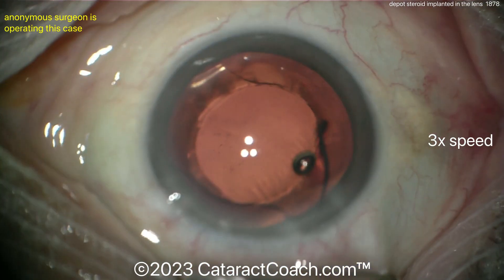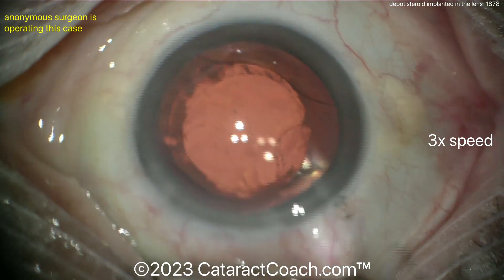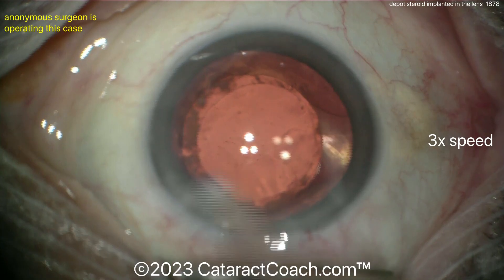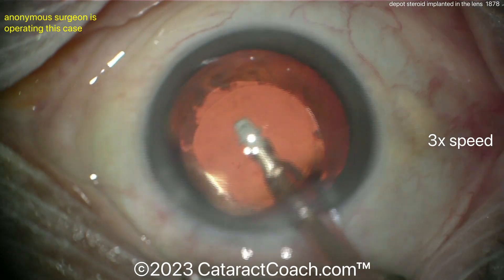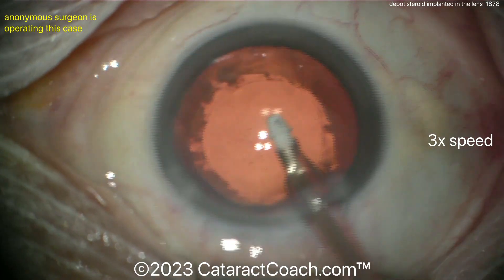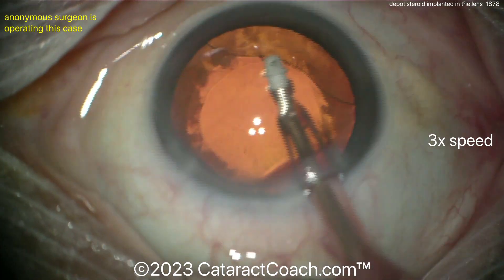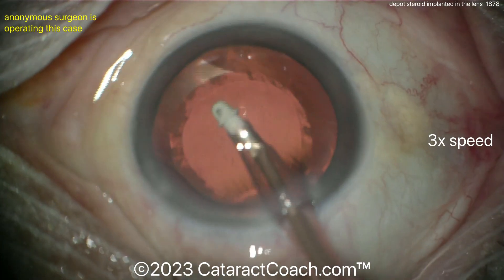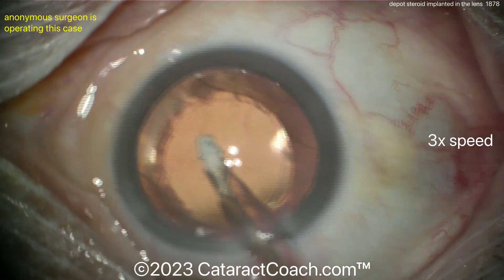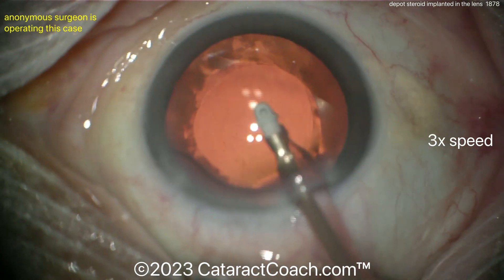Our surgeon is placing a single-piece lens in the capsular bag, getting it dialed in — and it actually holds up nicely. I still don't see a clear defect. Perhaps putting in some triamcinolone now to check for any vitreous prolapse in the anterior chamber. Cleaning up — please don't worry about polishing the capsule; we'll live with a little capsular haze, it's not a big deal.